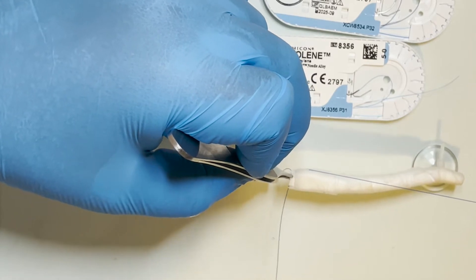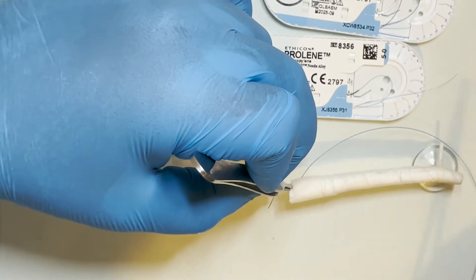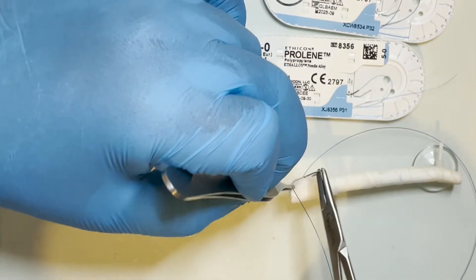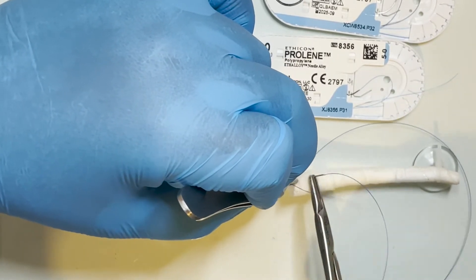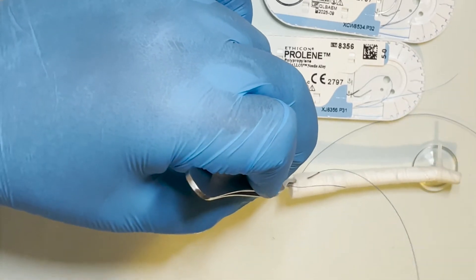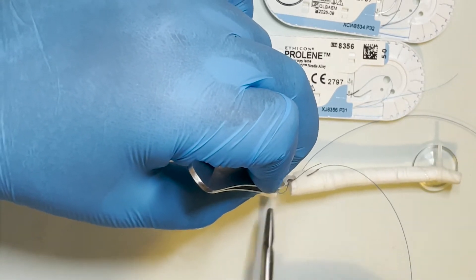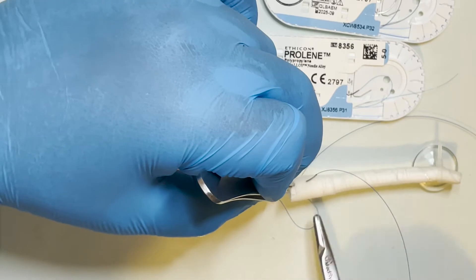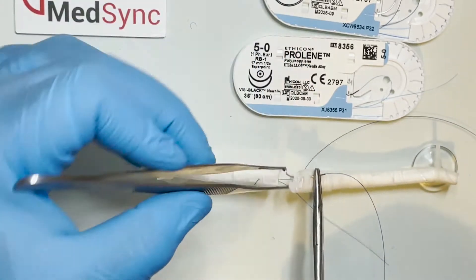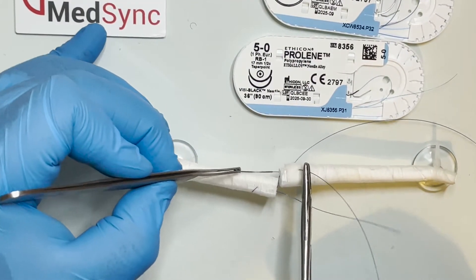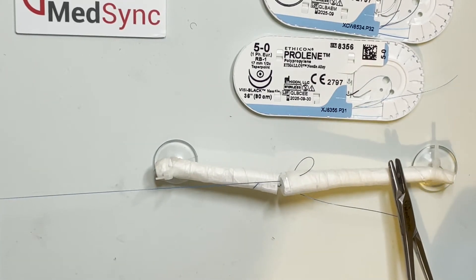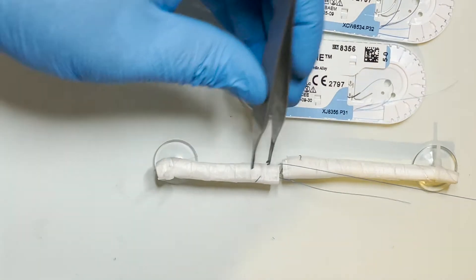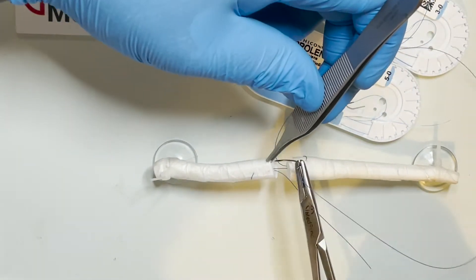An axial pass is again taken, this time starting proximal to the site of tendon division, across the repair site and into the other half of the divided tendon axially.